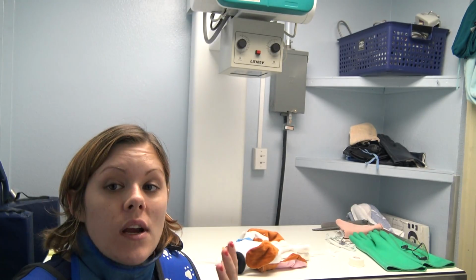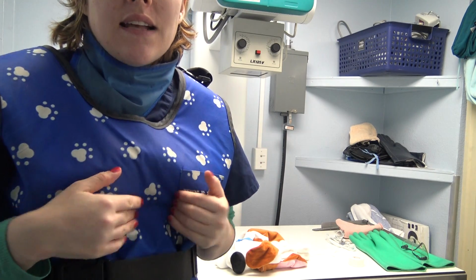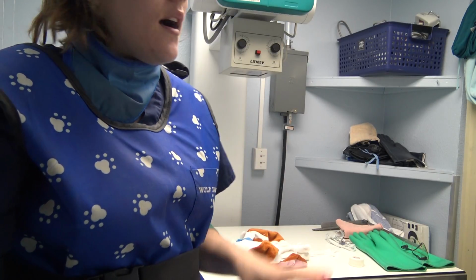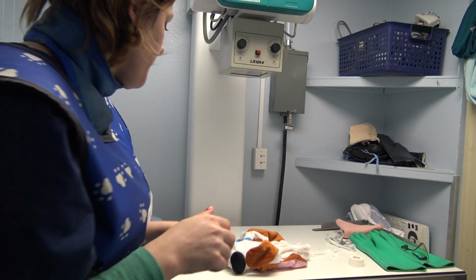I will also demonstrate all the proper protective equipment you're supposed to wear. Since I am pregnant, I'm still going to leave the room and hit the button from outside the room, because I don't want to be in the room when I'm taking my x-ray, but I'm going to go ahead and position it all and describe what I'm doing.